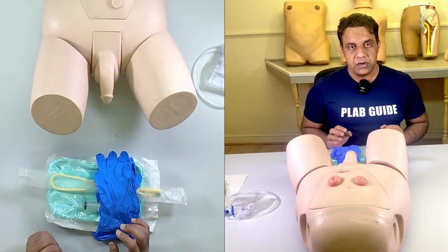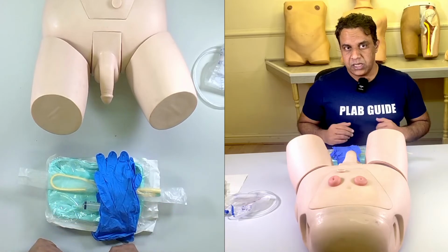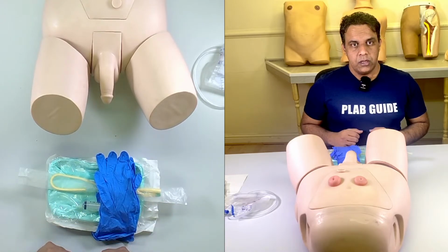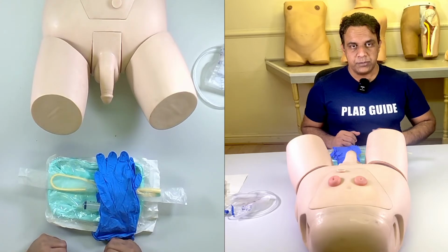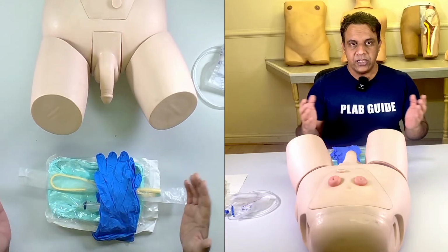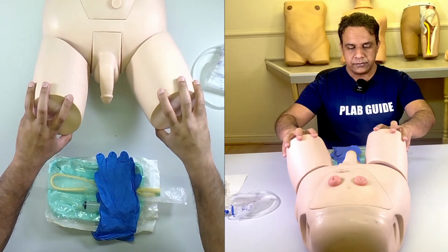They should be sterile. I will tell you when to change. At the moment, for the sake of this video, I'm using 1 pair, but I will tell you where to change to the next pair of gloves. The patient has to be lying on their back with both thighs apart.